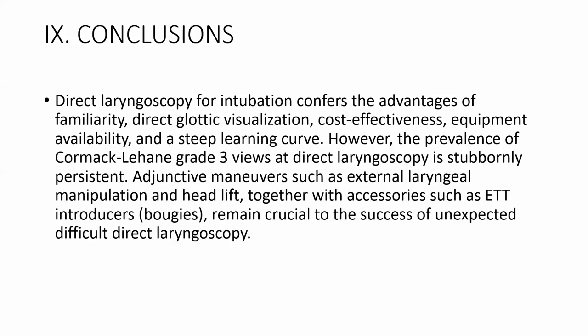However, you have all seen grade 3 views at direct laryngoscopy, and they are persistent. And the basic airway maneuvers such as external laryngeal manipulation and head lift, which is what you do when you do laryngoscopy. You actually lift the head up off the pillow most of the time, and together with accessories such as bougies, still remain crucial to the success of an unexpected difficult direct laryngoscopy.